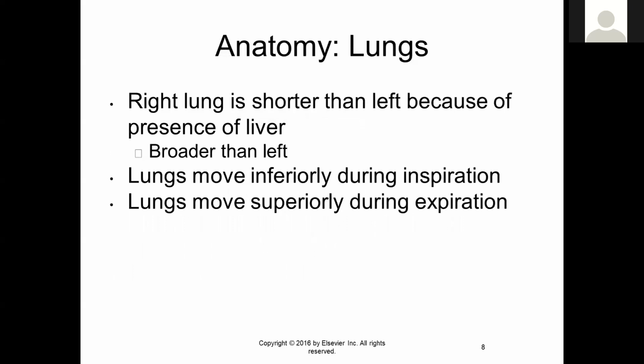Visually, on your image, the right lung is shorter than the left because you have the liver taking up space on the right side.